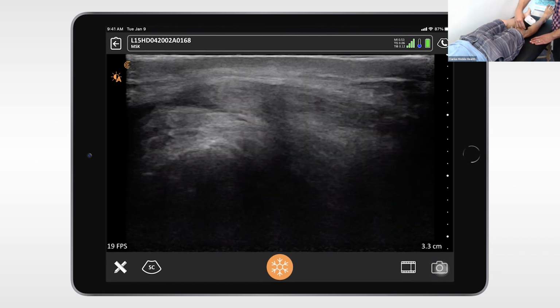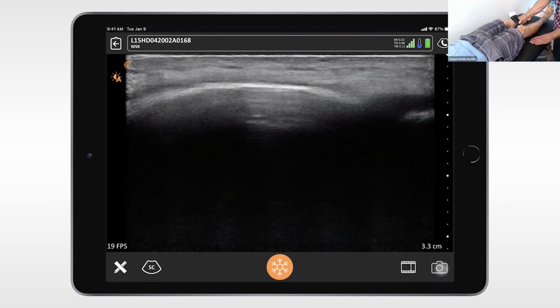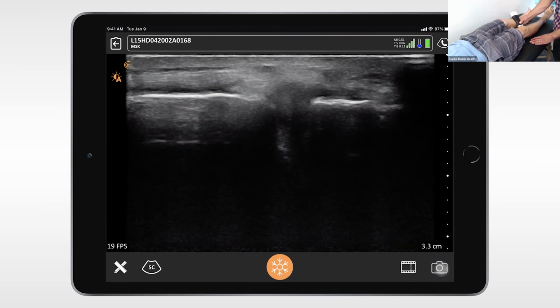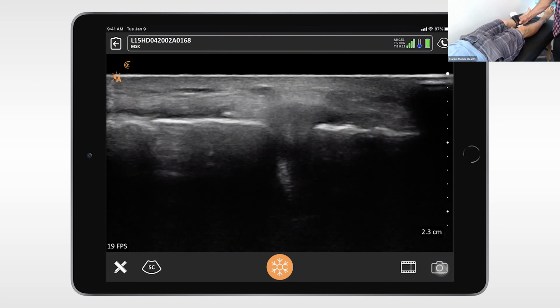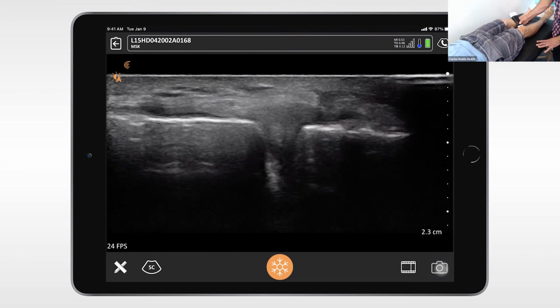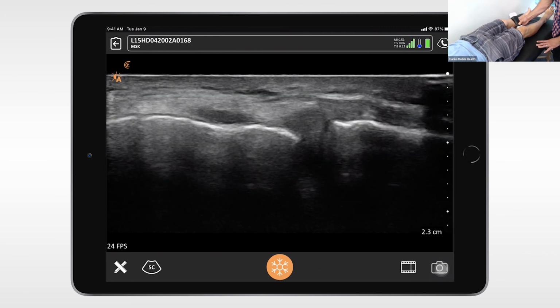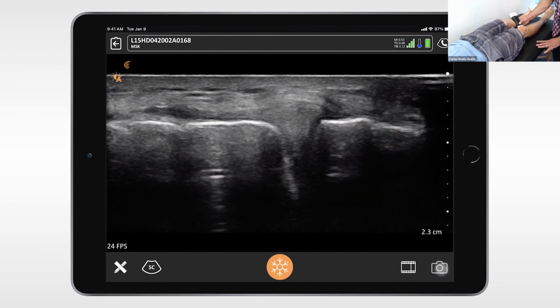Great. And what's new to me is coming down the joint too. I don't routinely look, and part of that is because I've never had access to great image quality, but being able to really evaluate the menisci, is that what I'm looking at right here? Yeah, we can see the medial meniscus in the joint space.